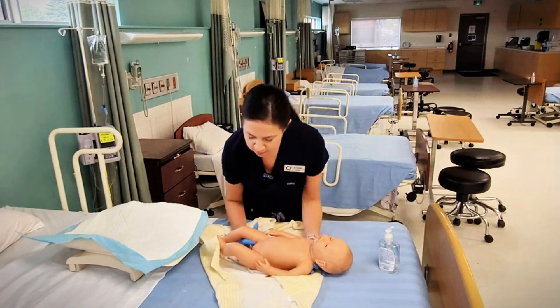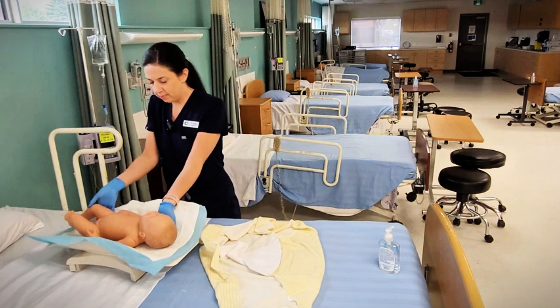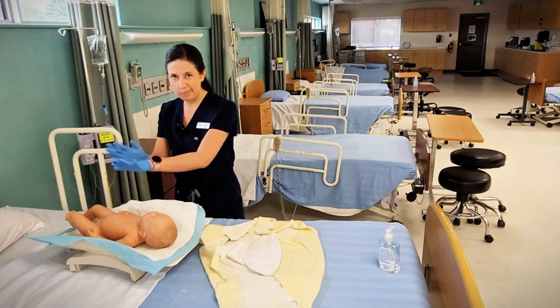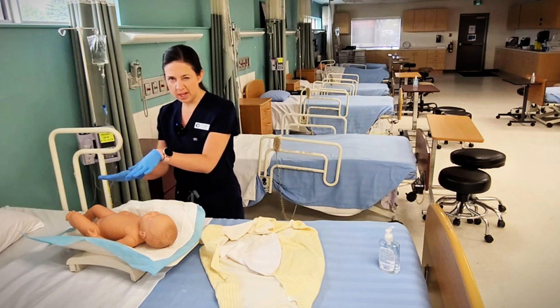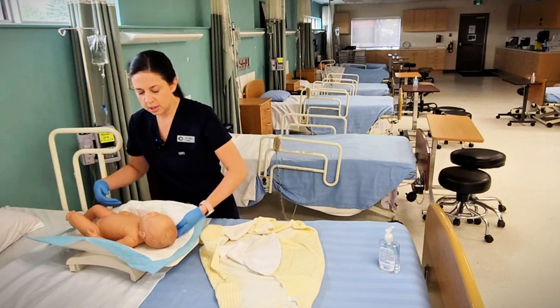I make sure I have a nice firm grip on my baby and place baby on my scale. Making sure I have my hand over the baby — not touching, but just to make sure baby can't roll. It should weigh automatically. I'm going to push re-weigh just in case baby was moving around or there was any extra added weight. I'm going to make sure I note that weight as soon as we're done.